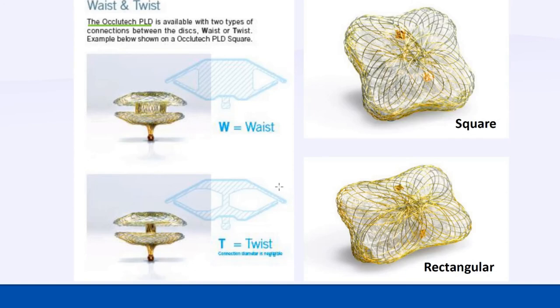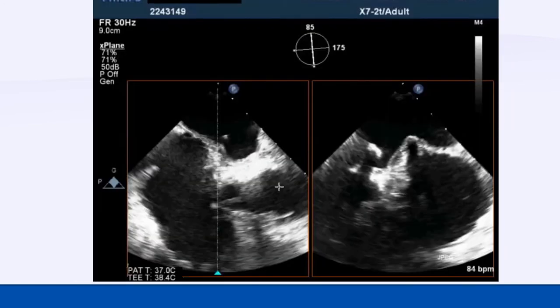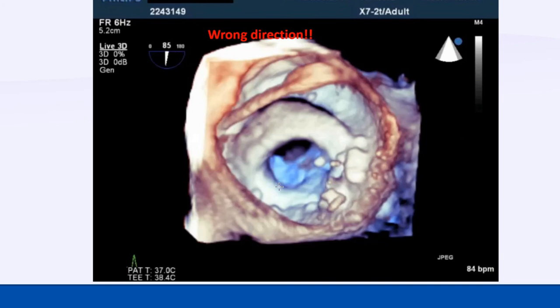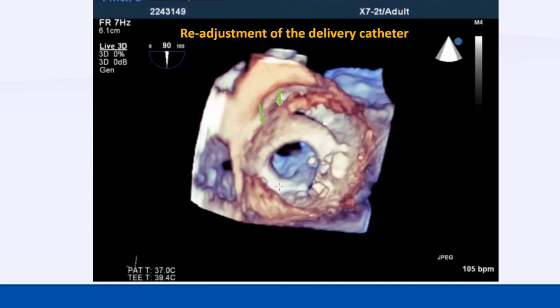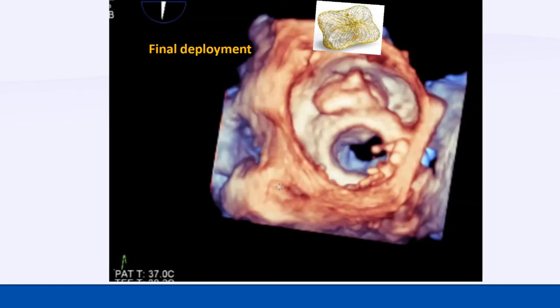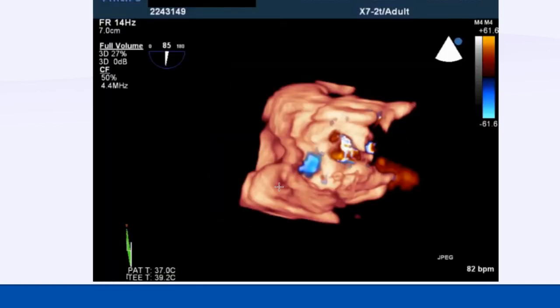We closed that large leak with this rectangular-shaped PVL device. Importantly, the device has to cross from RA to LA, so we must guide the interventionist. X-plane imaging is very important here to confirm you are going inside the LA, not outside the heart. The catheter was initially in the wrong place, but we guided them, they repositioned, and placed the device. The result was not perfect but the leak was reduced and accepted, and the patient survived.